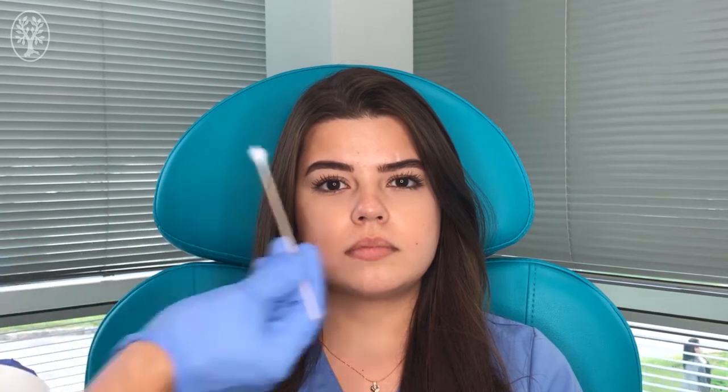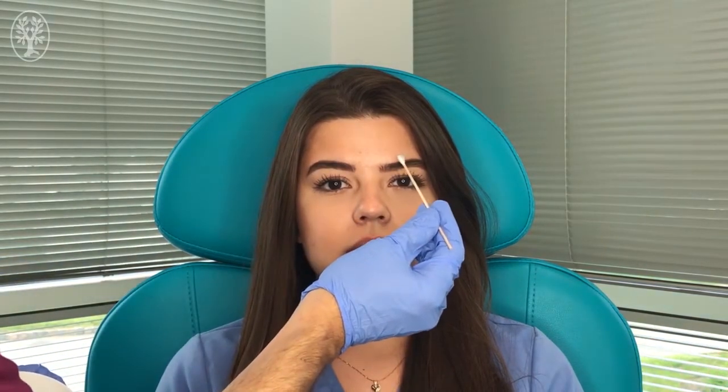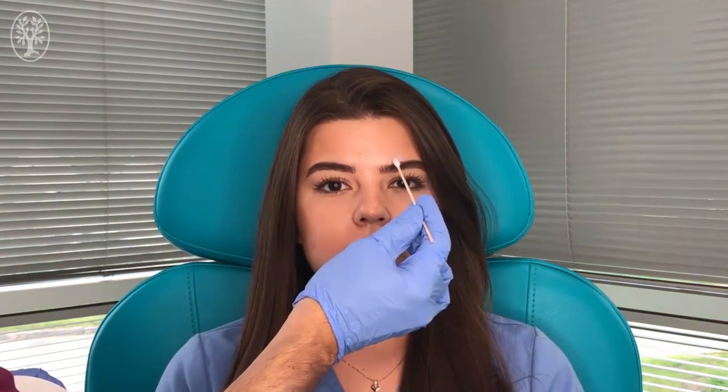In order to do the nerve block, first we are going to numb the area with some topical anesthetic. That's to decrease the discomfort of the first injection. And we're going to let it sit there for a few minutes.